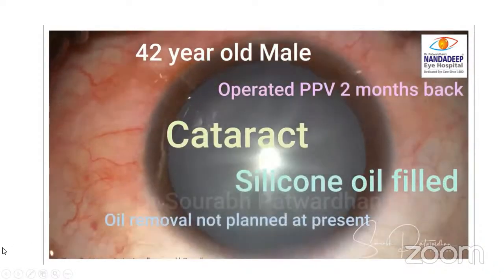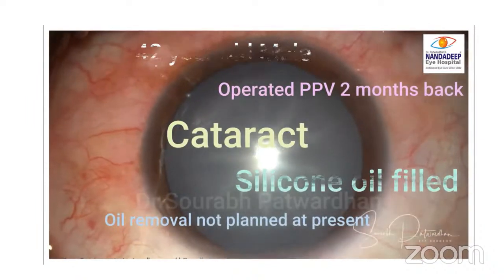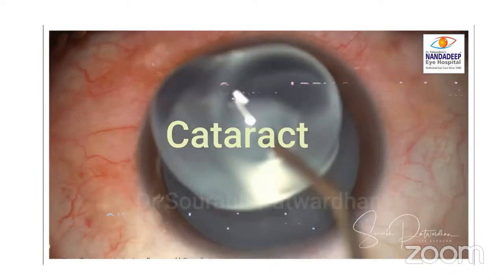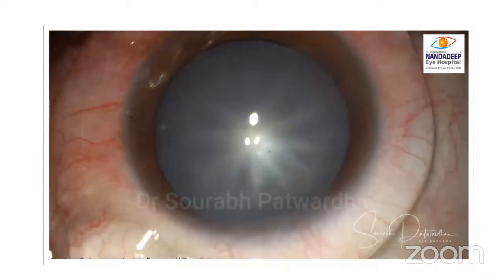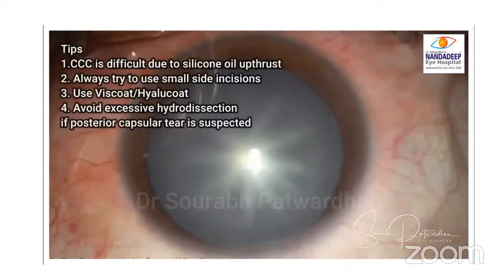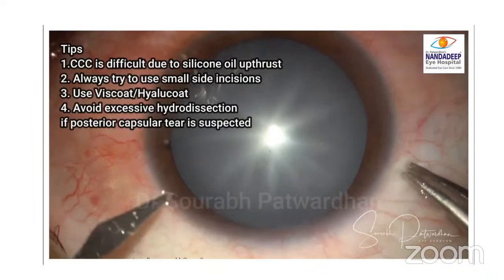The surgeon has advised removal of the cataract, and oil removal is not yet planned. This is quite an early post-operative period, just 2 months, and there is almost a near total cataract. In such cases, you have to be careful about posterior capsular touch during vitrectomy. CCC is difficult in these cases because of the silicone oil upthrust.